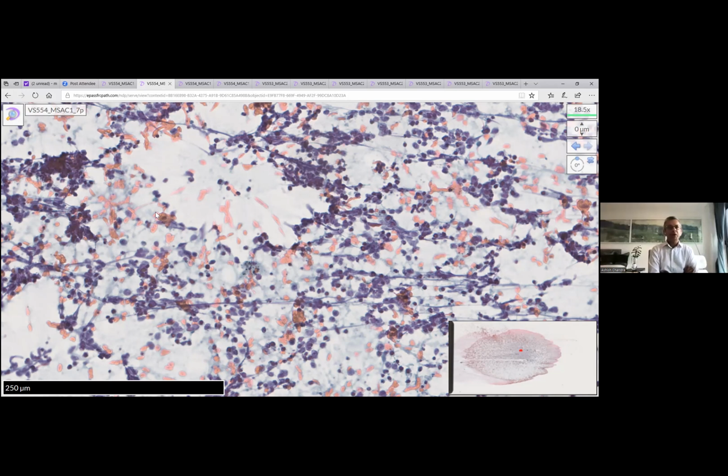Absolutely, I agree. I think the top mark here would be for a confident recognition of the cytomorphological features of a small cell carcinoma, and to say that you would just confirm your diagnosis by doing the neuroendocrine markers. If you have a differential diagnosis, say with a high-grade lymphoma, describe the features that Maria just told you about, to say which of these features is there or not there that is resulting in your differential diagnosis, and then how you would resolve it.